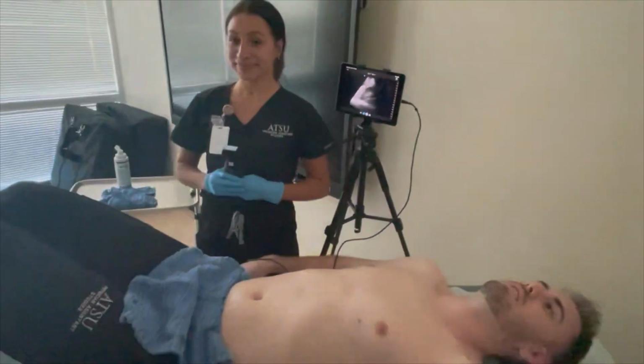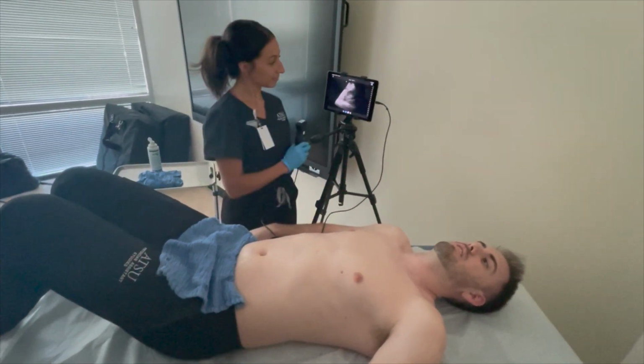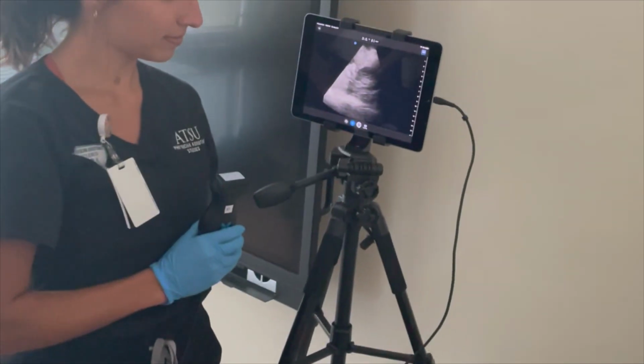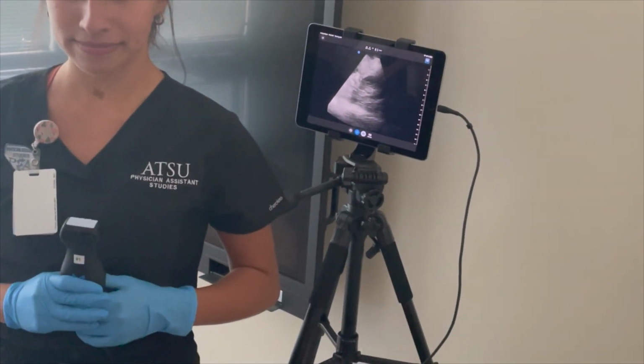It's used to evaluate for free fluid collecting around the spleen, also in the chest at the costophrenic angle in between the diaphragm and spleen. A tip is also to ask the patient to hold their breath to keep the organs from moving and allowing the probe to fit between the ribs.